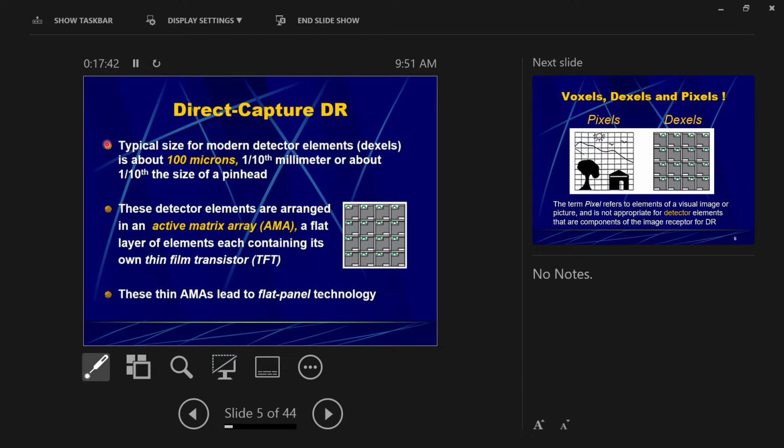And grayscale is how many shades of gray are actually being used on the image. You're always using less dynamic range than your bit depth, and you're always using less of a grayscale than your dynamic range would allow, just simply to save processing time. Remember, the human eye at any one time can only identify 32 different shades of gray, right? So giving you 4,000 of them is useless because the human eye, the thing we're using to evaluate images, can't do that.